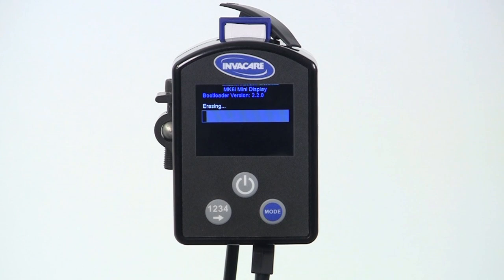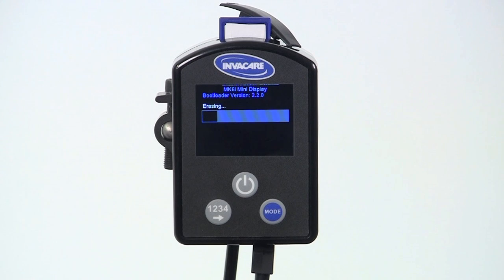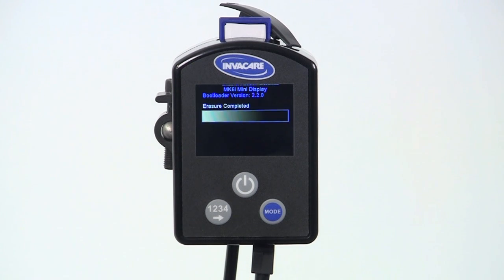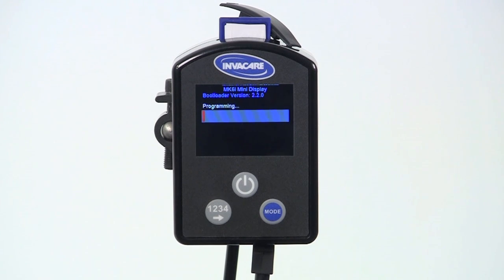At this point, your display will show the software updating to the wheelchair in three steps: erasing, programming, and verifying. This process will take between one and two minutes. It's important to note that the programming values on the wheelchair are not changed in the process of updating the software, even though the display reads erasing.